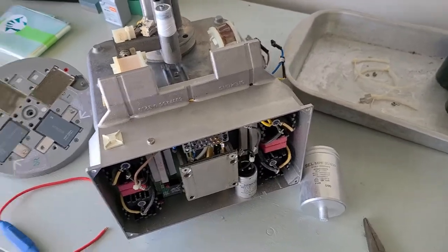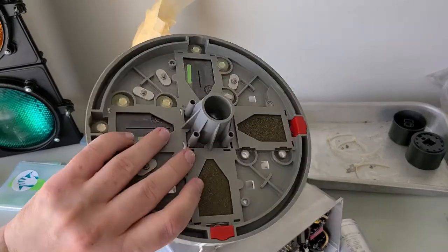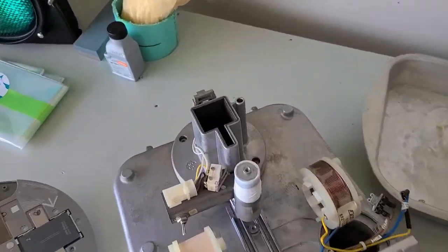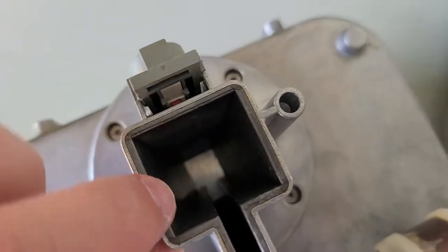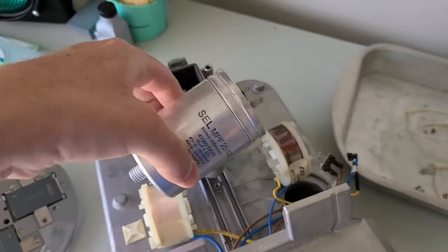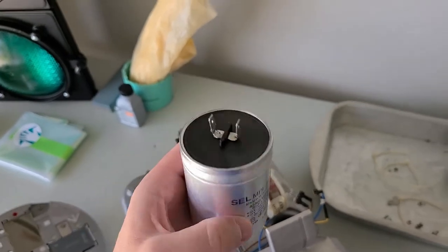Alright, so I went ahead and got a couple panels off and I also got off the collimator assembly here. You can see the small metal strips for the x-ray beam. And here's the actual collimation tube that's built in. So all lead lined here inside. There was a giant capacitor here on top. It was right here between here. I did make sure it was safely discharged before, you know, handling it.